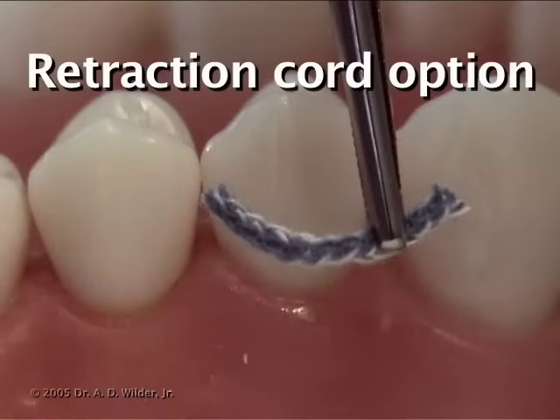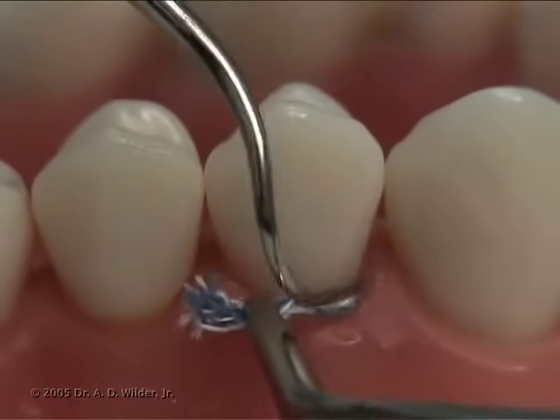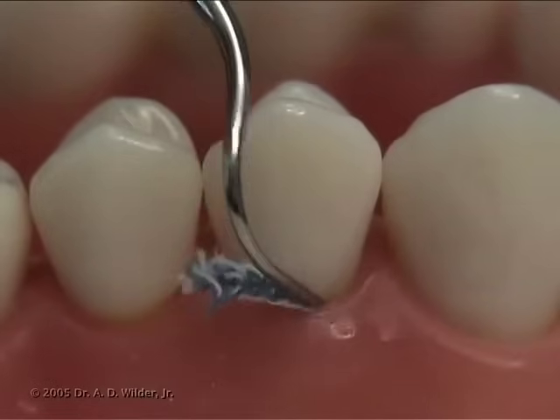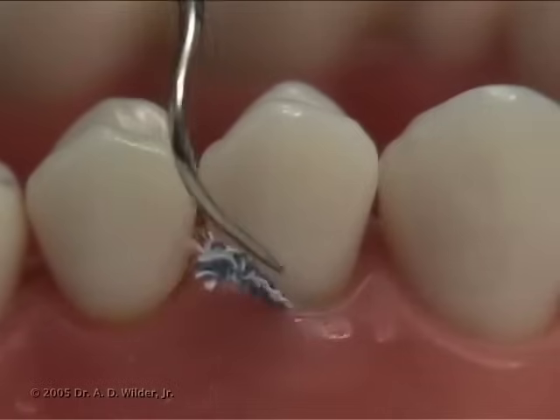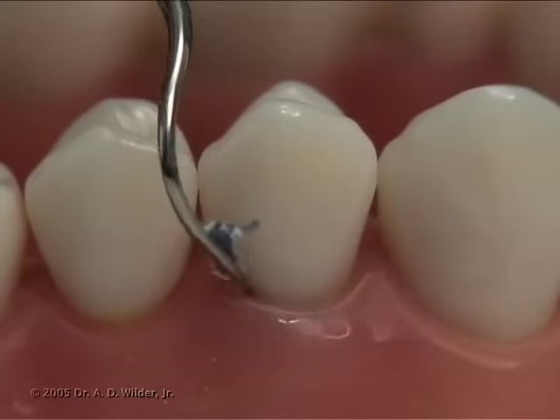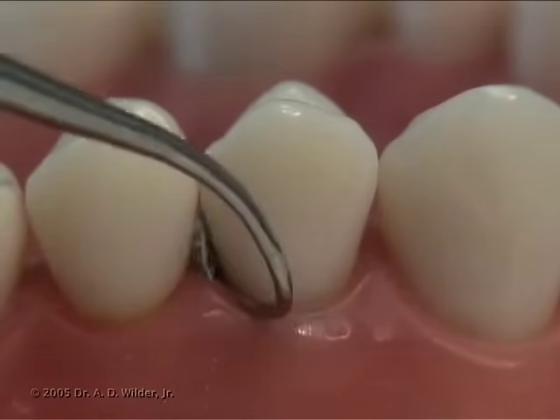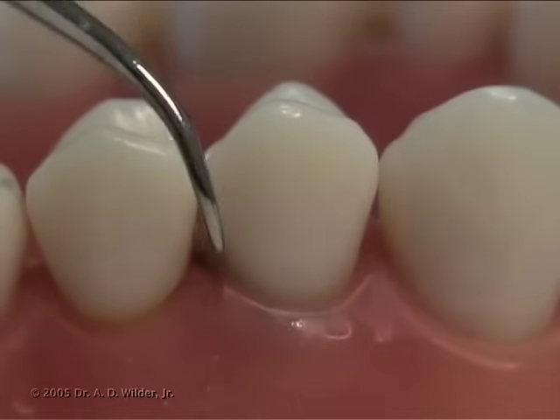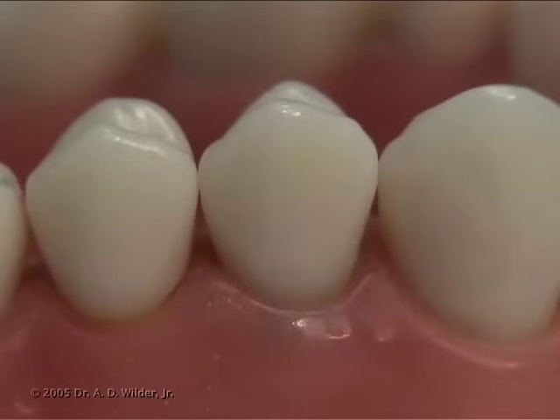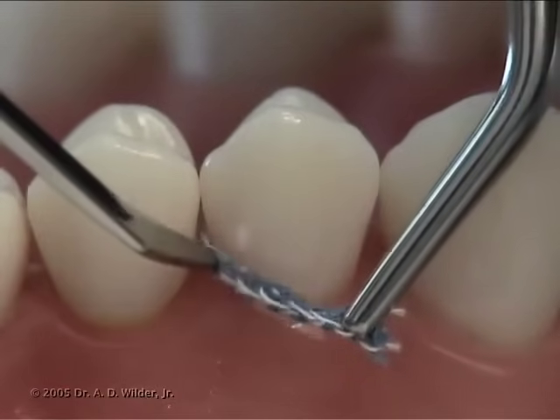An alternative option for isolation is using a retraction cord and cotton rolls. The cord is first brought adjacent to the gingival sulcus with cotton pliers and then placed into the sulcus by using a flat instrument or an explorer, carefully but firmly pressing down on the cord along the contour of the tooth, walking it from one interproximal area to the other. Note that you should always start from the interproximal area where the cord is easiest to compact. If the tissue is blanching, select a smaller size cord. An FP1 instrument is another great choice.